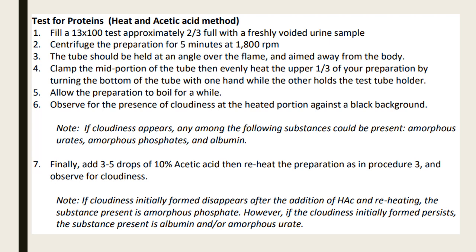So you reheat the preparation as in your procedure 3 and observe for cloudiness. If the cloudiness that initially formed disappears after the addition of acetic acid and reheating, the substance present is phosphate. But if the cloudiness persists, then probably it is albumin or amorphous urates.